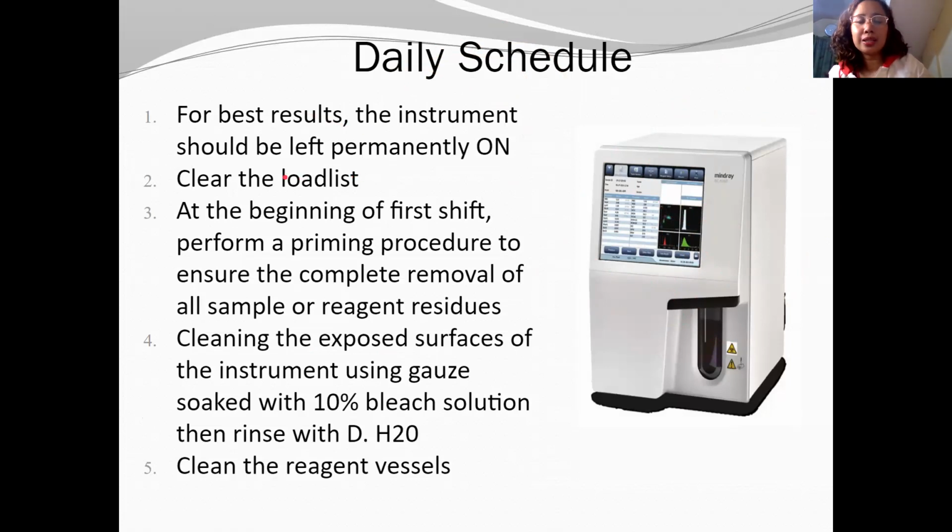So, clear the load list. Example, yung mga name ng patients andun. So, you could clear it, to start the day again. And what else? You could do a priming procedure. Kumbaga, i-clean. Priming. Usually, every shift ginagawa to, every 8 hours pwede gawin, or every 24 hours. Okay, priming procedure. What's the purpose? To remove all the samples and reagent residues in the tubings.